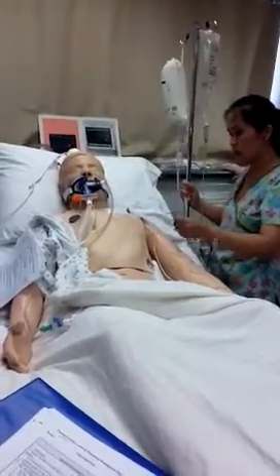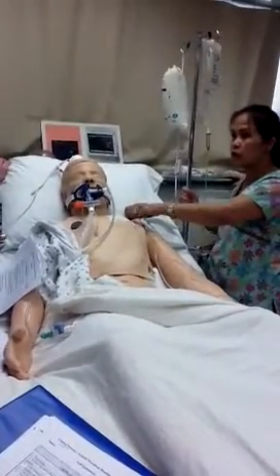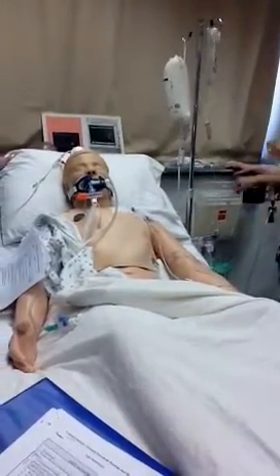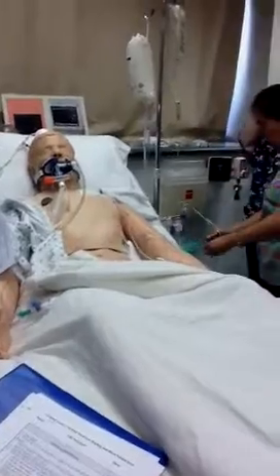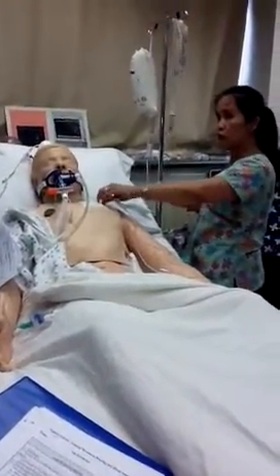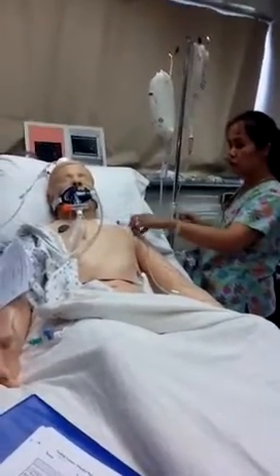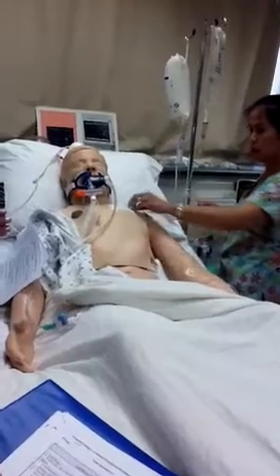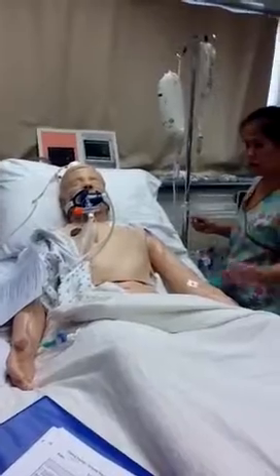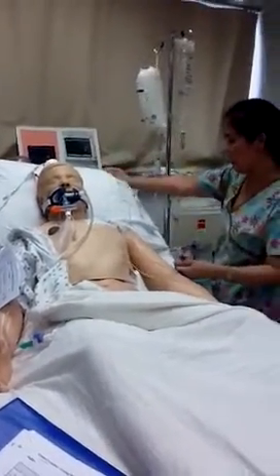Okay. So you just clamp it when you're zeroing it? No, you don't. Let's say there's 2. This one is the IV fluid. So this one you can turn off. But this one, of course, if it's infusing, you unclamp it. But if you're not using it, like this one, make sure it's clamped. Make sure you flush it with normal saline. And this one's always going to be open if you're transducing. I just turn it off when I use it for the art line. But usually they have their own. Okay, so that's that.